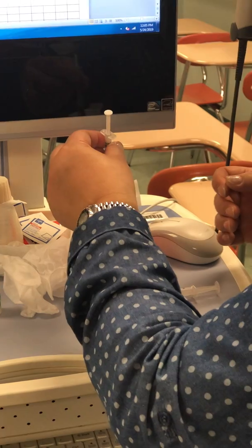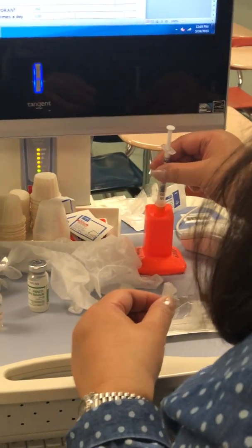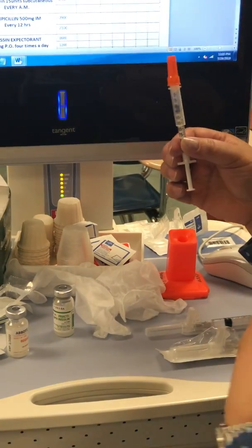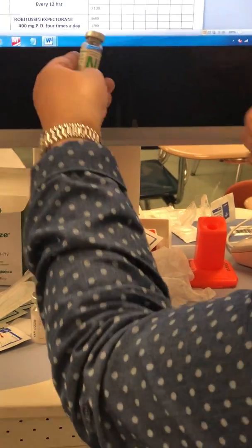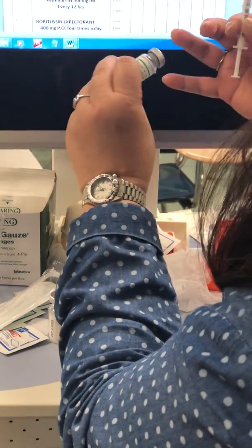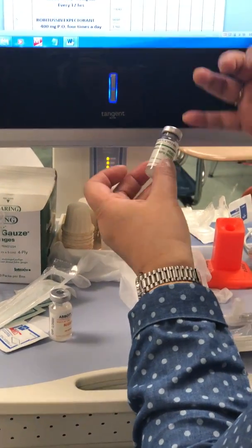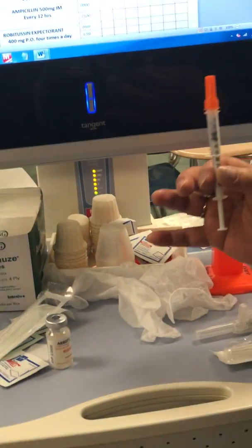So we will recap. We have our cup here. Okay, and do your second check, all right? Second check always with the syringe. So doing my second check, Chelsea Abbott, NPH, okay, I took 15 units and expiration date.